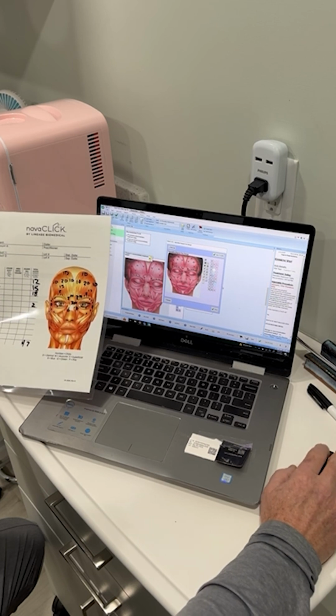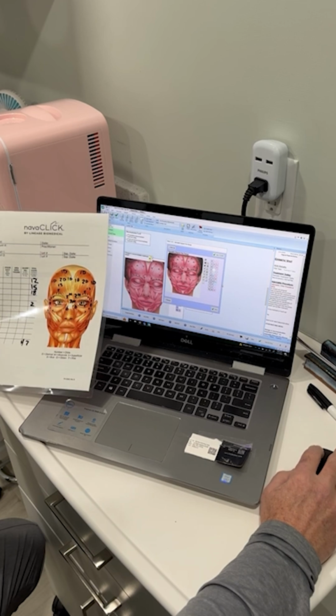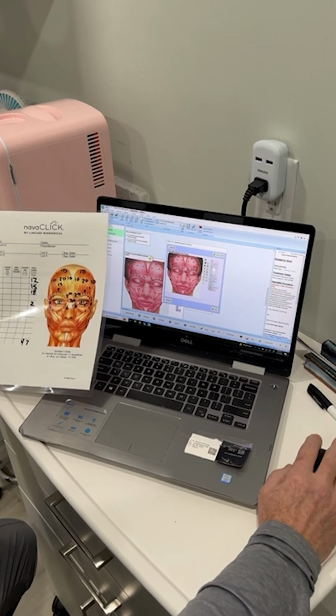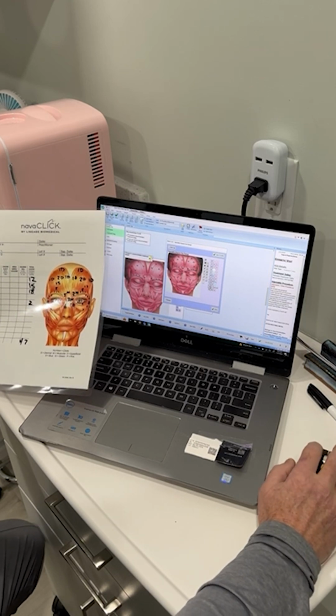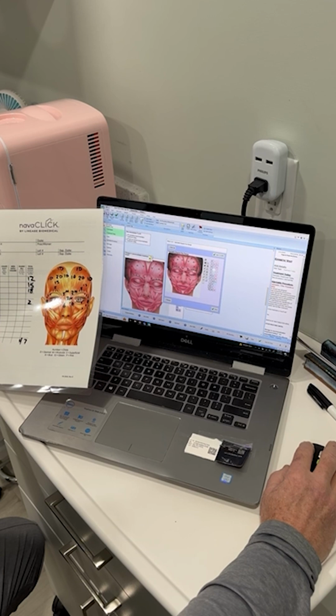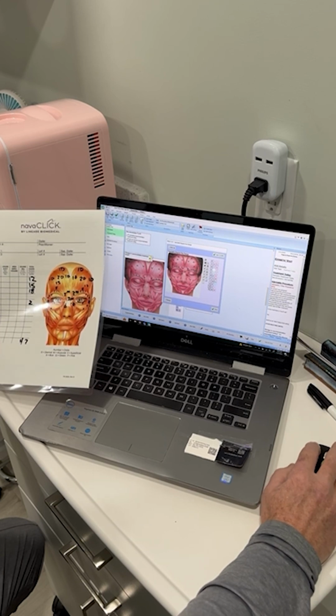All right, so the orbicularis, or the depressors, crow's feet, most of these are all dermal because that muscle is attached to the skin. So when you get in the dermis, you're actually touching the muscle. So I'm going to do 3 here because I have those creases that show that my depressor muscles are very strong.